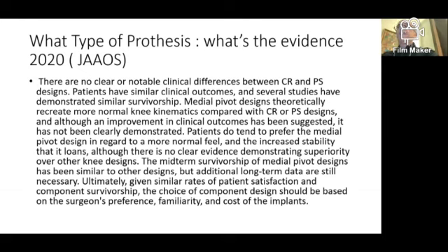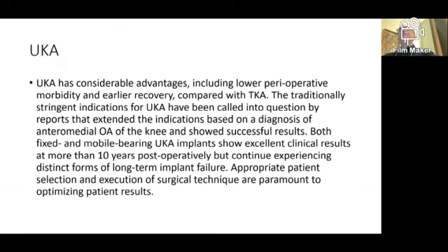Given similar rates of patient satisfaction and component survivorship, the choice of component design should be based on the surgeon's preferences, his familiarity, and the cost of the implant in our environment.